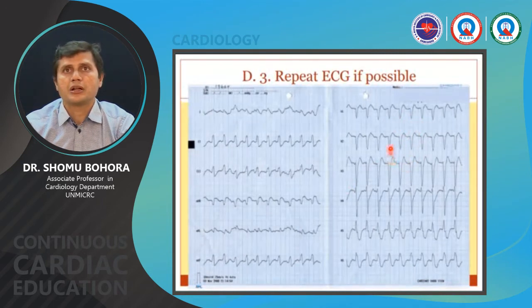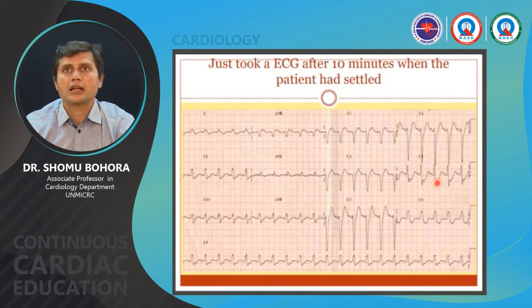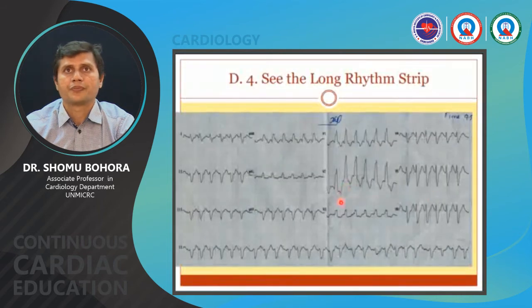So in this patient, you have a broad complex rhythm, regular, with no P wave seen but no dissociation also seen, and a diagnosis of SVT with aberrancy was kept. Repetition of the ECG brought out the P waves, which were sinus-like, and this was likely to be sinus tachycardia with ongoing ischemia, and therefore repetition of the ECG when the rate settles is very important.